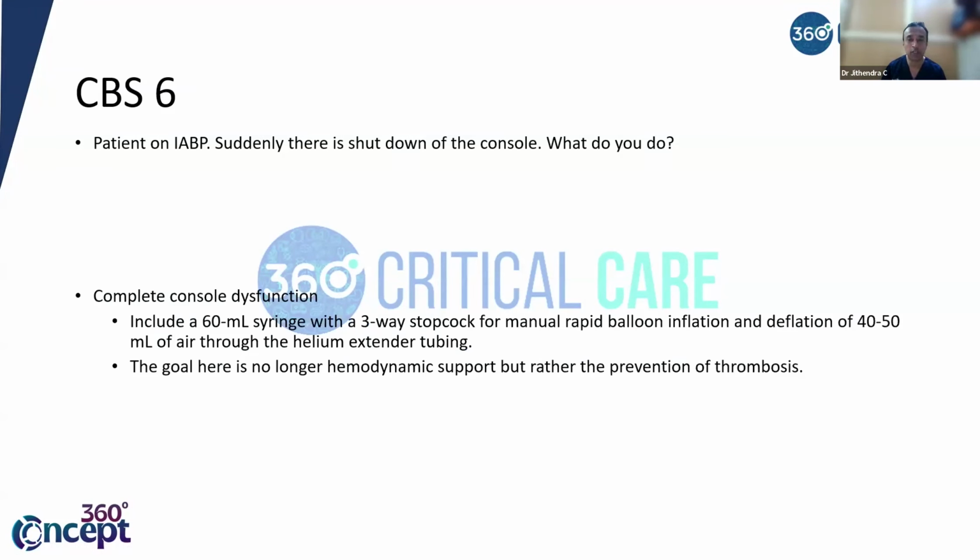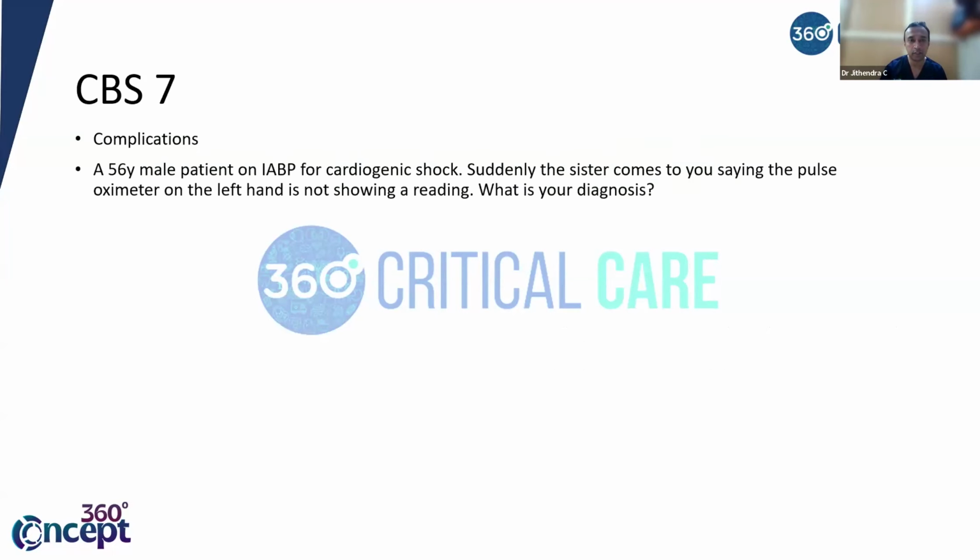and deflate. This is not to support the heart. This is only to keep the balloon inflating and deflating so that it doesn't get clotted. Because we know if we leave the balloon there, it'll be prothrombotic, it'll clot, and that clot can get embolized and you'll have complications later on. You'll do it manually using a 60 ml syringe, but your intention is not to support the heart. It is not for cardiac support, but is only to keep the balloon moving so that it will not allow any clot to form. Okay, so this is another answer.